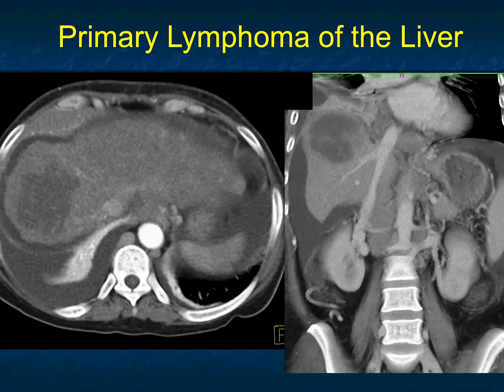In this case, it was lymphoma — which is why we do get biopsies. A low-density lesion in the liver: lymphoma is something we don't think about in the liver very frequently. You can have primary lymphoma or secondary lymphoma. When you see lymphoma in the liver, almost invariably you'll see splenic involvement, which is far more common. You'll often see bulky adenopathy. This case is a good teaching point: go through the differential diagnosis, and at the end of the day, you may need a biopsy.